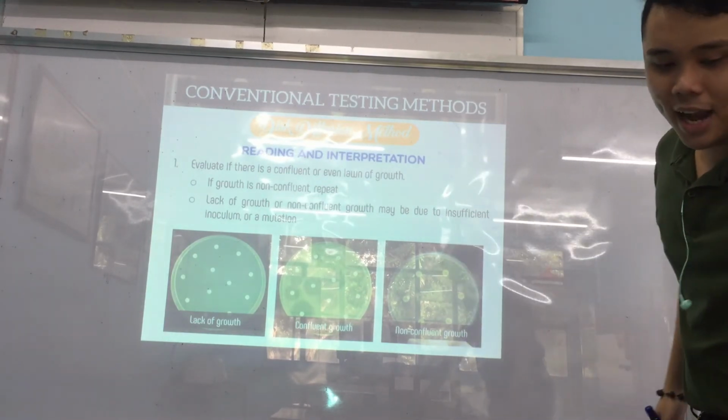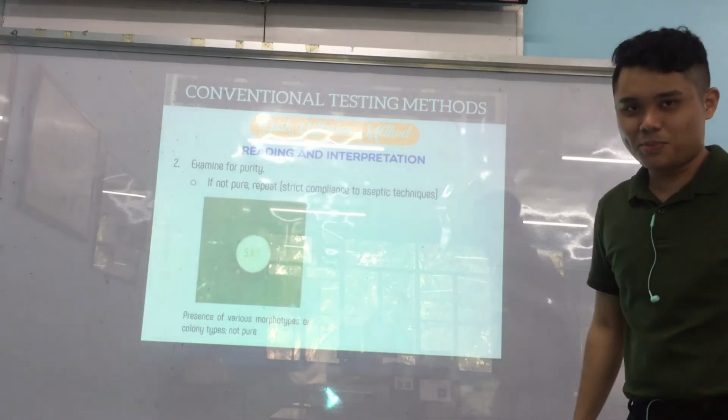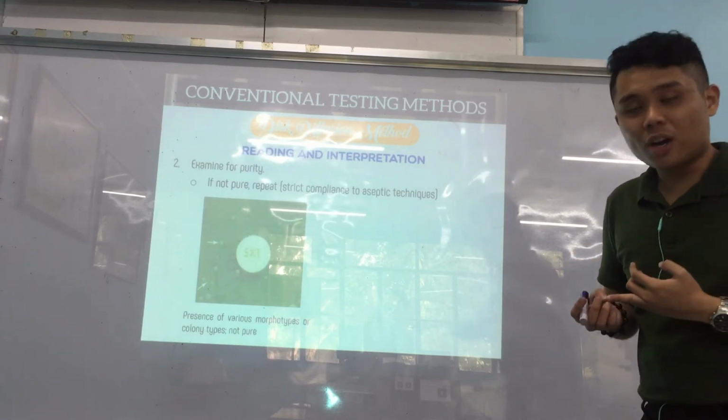Okay? All right. And for reading and interpretation, first we have examine for purity. Pure ka pa ba? Charot. If not pure, dapat ato i-repeat. Okay? We make sure again that the organism is pure from a pure culture.